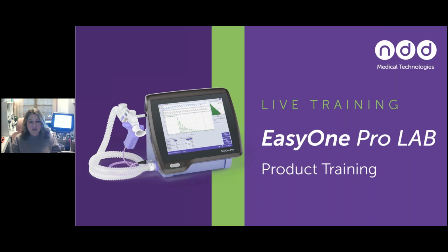Looking at multiple breath washout, across the gamut of methods of measuring lung volumes, we can expect up to a 10% difference from method to method. Whether that's body box to multiple breath washout, DLCO to multiple breath washout, or DLCO to body box, there's going to be some variability just because of how the maneuver is performed.